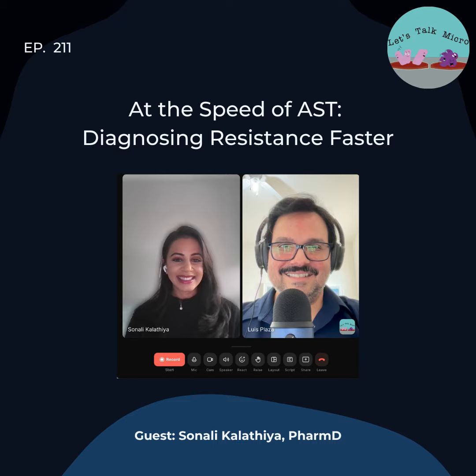Definitely. Okay. So, as by now we have mentioned, with your conventional AST, you have that time that you have to grow the organism, 18 to 20 hours, 18 to 24 hours, and then you put it in an instrument, and we have mentioned things, for example, like the Vitek, which many labs use. Depending on the organism, for gram negatives, you can get that susceptibility in 8 hours, sometimes; gram positives, more like over 12. On things like strep, it can be 20 to 24 hours. So can we talk about how the fast AST works, from isolate to the result?